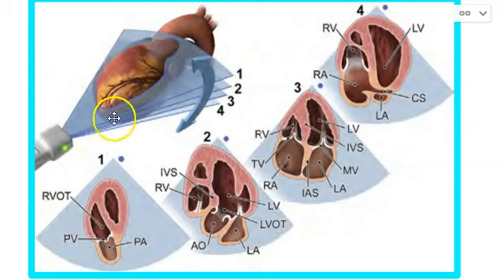And again, this is from the four chamber view and how you can rotate the probe. See how this is going position 1, 2, 3, 4, and how you can slice through here. In the perfect patient, you could actually get the pulmonic valve in there from the four chamber view. Think about that for a second. You could probably do that on Bob.